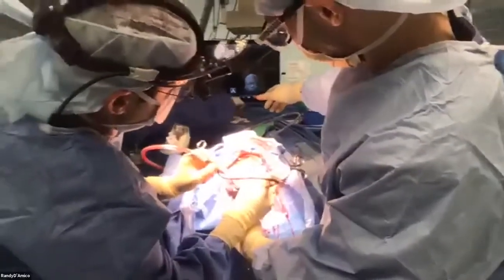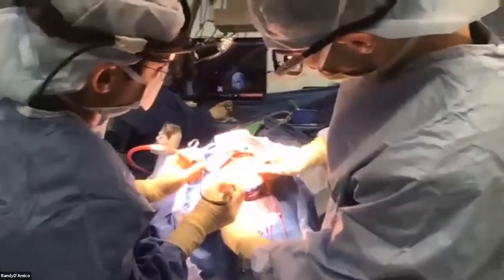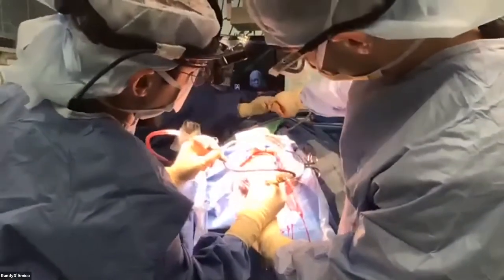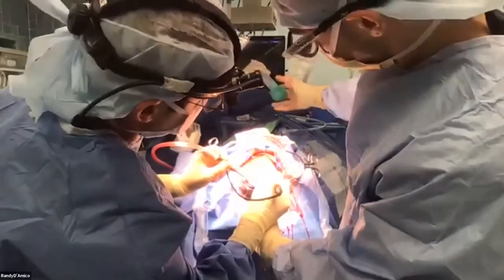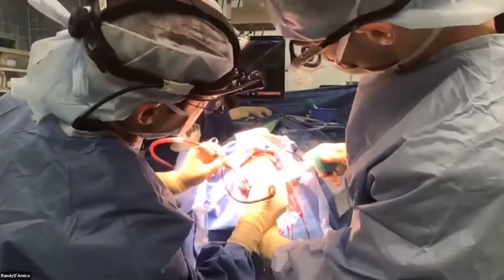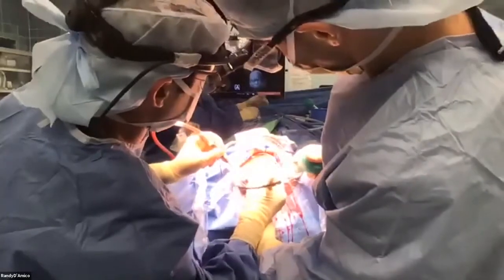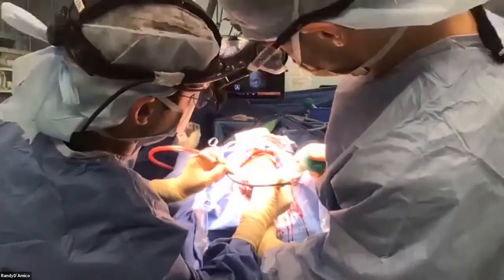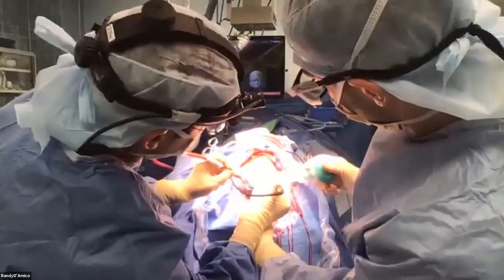All right. Double ender. Perfect. Watch yourself. Here you go. So this is all hyperostotic bone, right? That's what you gave me here. Irrigation. So you're not through there. Yeah. Good. So this is the boring part. Sorry, guys. You can see, right? You got good visualization. Let me see wax on a stick or wax on a finger again.